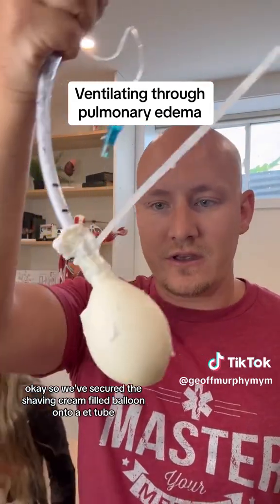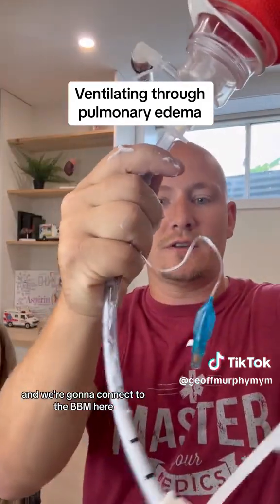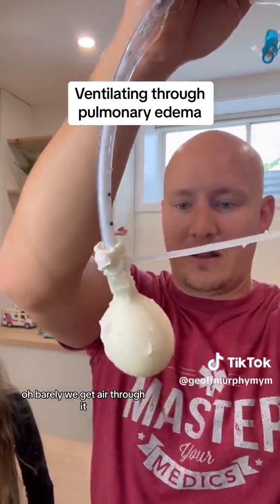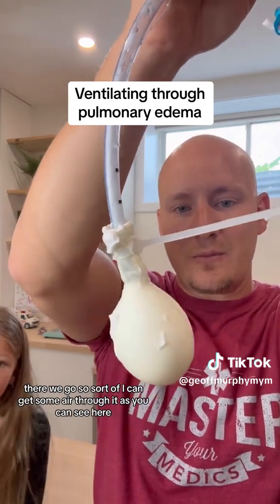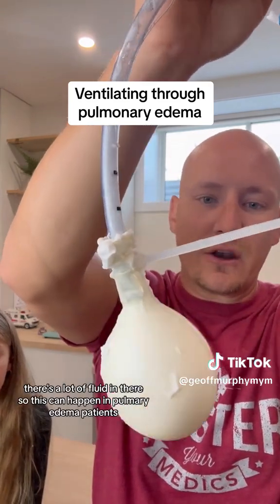We've secured the shaving cream-filled balloon onto an ET tube and we're going to connect to the BVM here. Let's see how much more difficult it is to ventilate. I can barely even get air through it. I can get some air through it as you can see, but it's quite difficult.